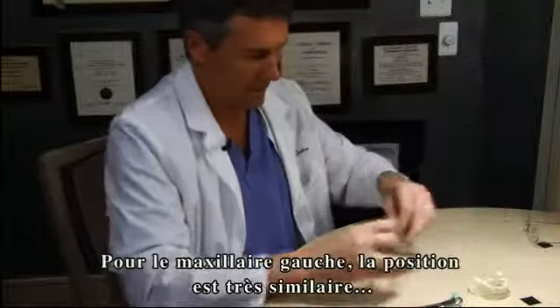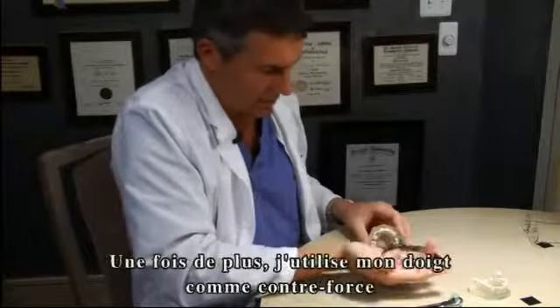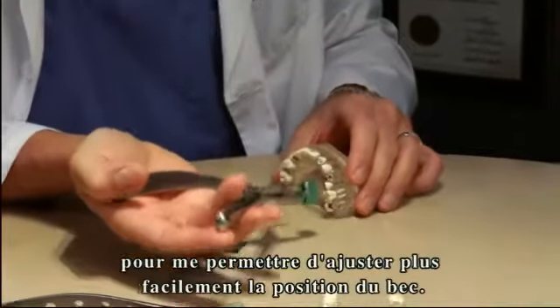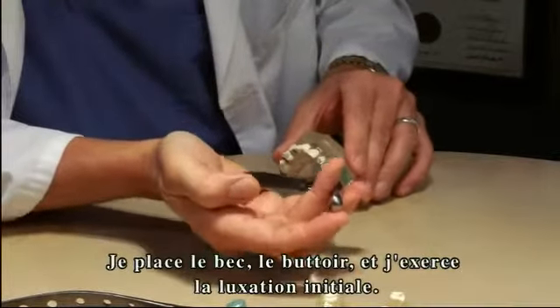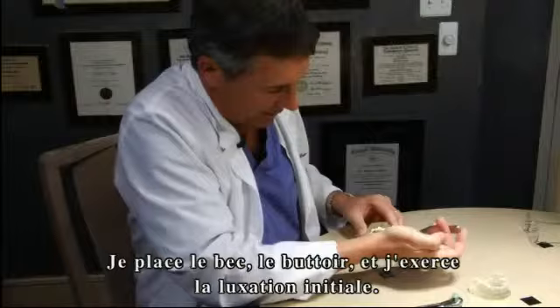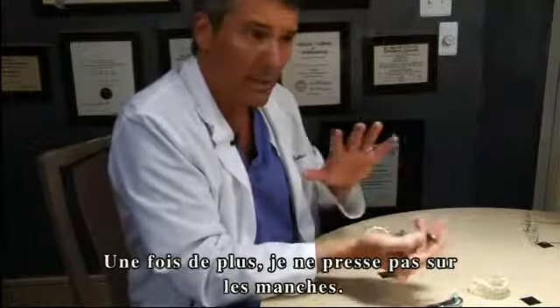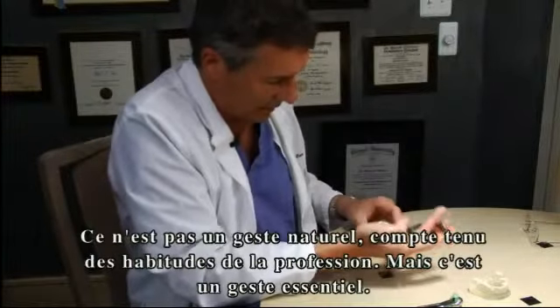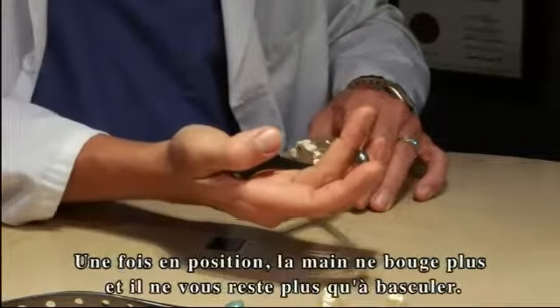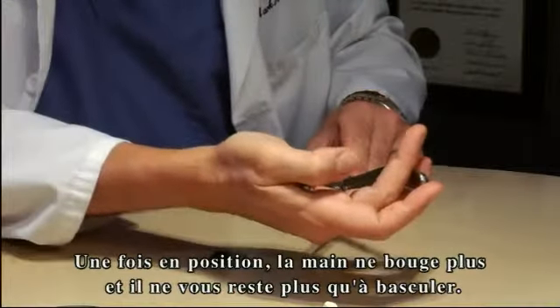An upper left hand position is going to be somewhat similar. Again, I've got a finger in between the handles to allow for some variability of beak position, then positioning the beak and delivering at least initial luxation with a pivot point. Again, it's not squeezing — you've got to get past that, which is very difficult given our dental history. But you can vary the pivot point by moving your hand. Once it's set, the hand position is fixed, and at that point you can provide delivery.